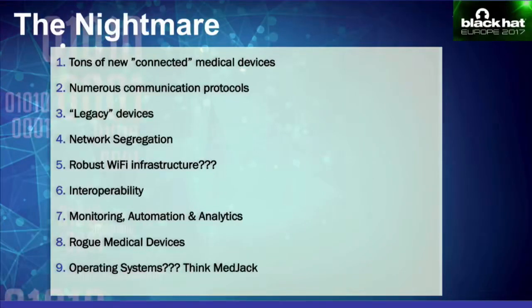Second would be interoperability. A lot of these devices are manufactured by tons of manufacturers. They can talk on different protocols. They might have different data formats and request formats. So it'll be a challenge to get these devices to talk to each other. Then there is authentication and authorization itself. How do you differentiate a legitimate device from a rogue device? I can as easily take a rogue device and try to associate it with the hospital network. And if that part is not handled securely, then there could be problems there.